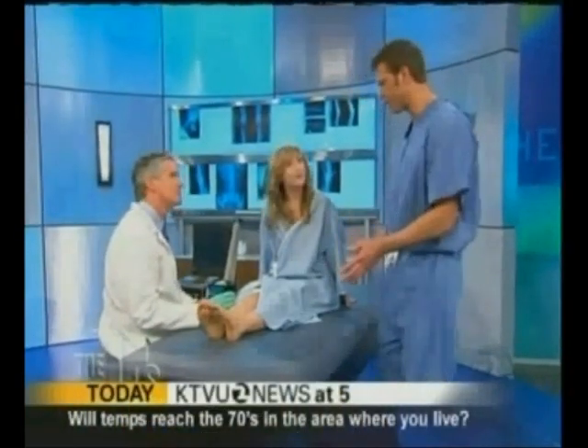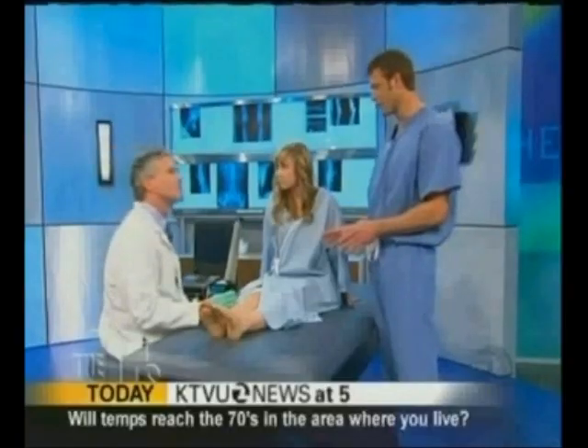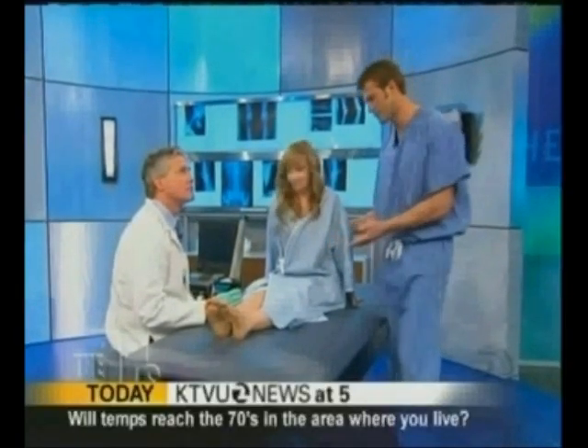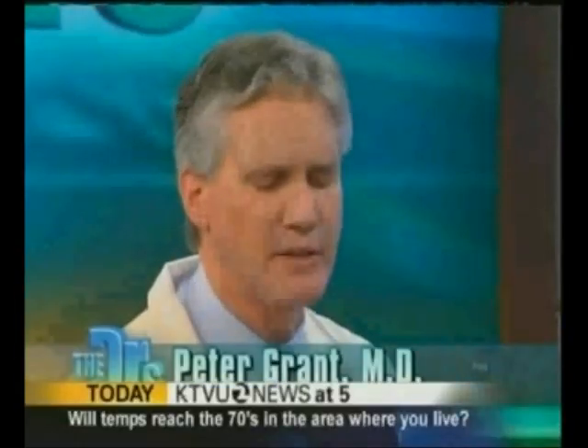We got Amanda all hooked up and we're going to do this EMG test to test her conduction. The EMG is a test of muscle and nerve function. Basically, it sort of puts her muscles on TV, and by looking at the screen I'm able to identify whether there's any problem with the muscle or nerve.